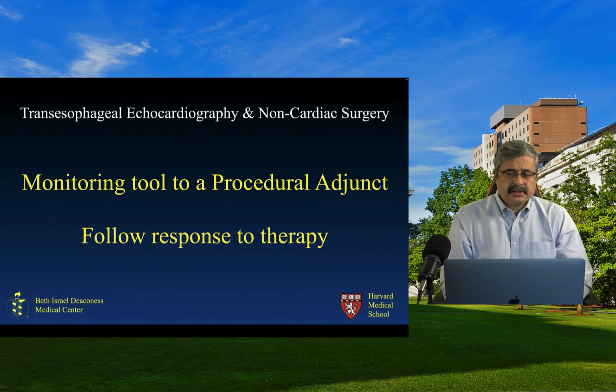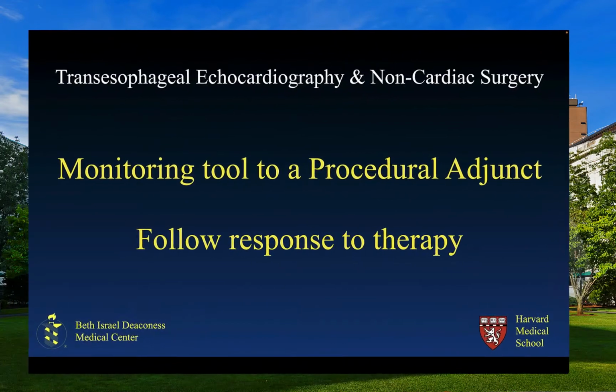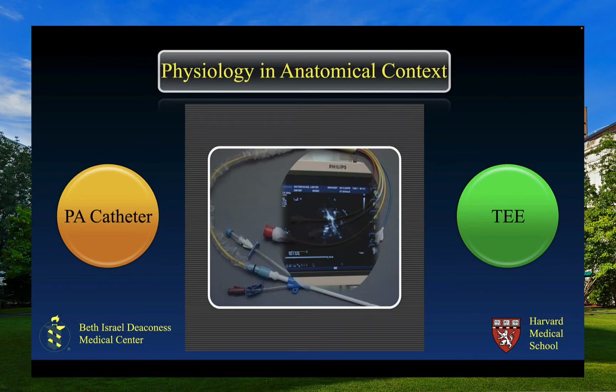So let's discuss the role of transesophageal echocardiography as a monitoring tool or as a procedural adjunct or as a tool to follow response to therapy in patients who are undergoing high-risk non-cardiac surgery. Well, now that role is not as well established as that for acute emergencies. However, one of the most important things for transesophageal echocardiography is its use as a hemodynamic monitor.